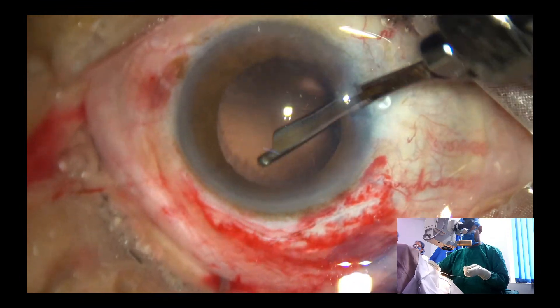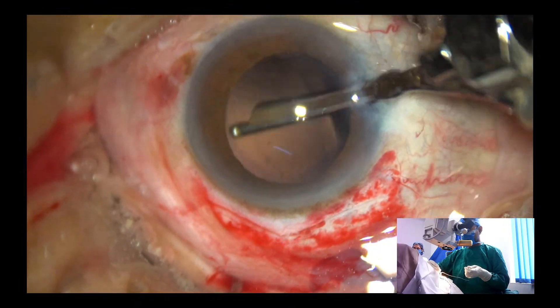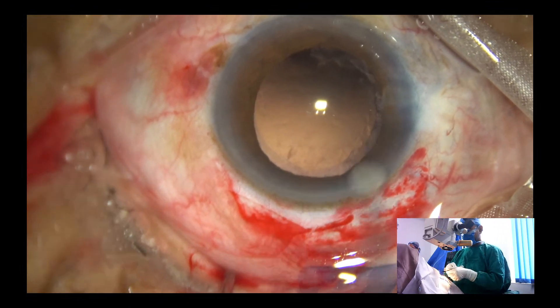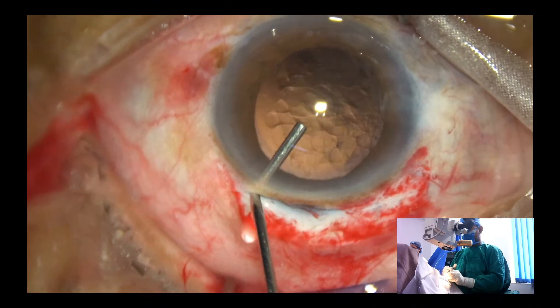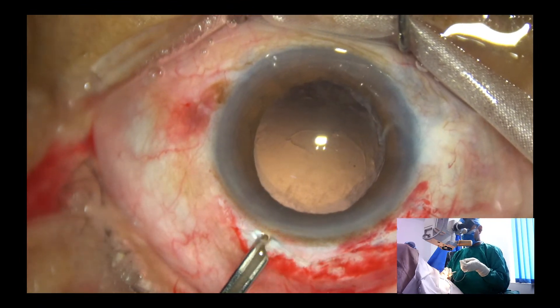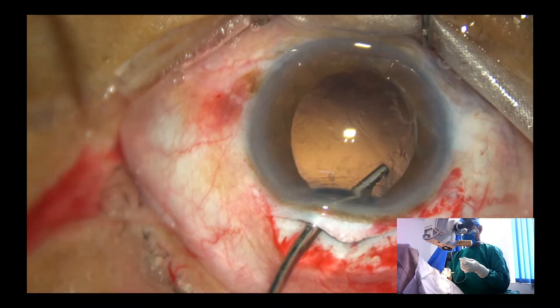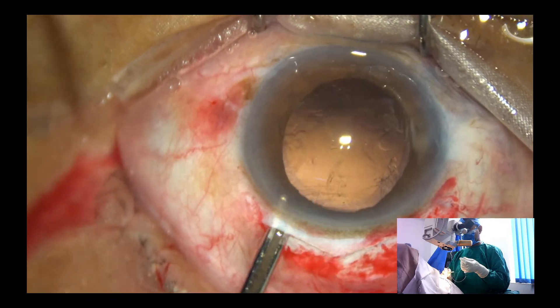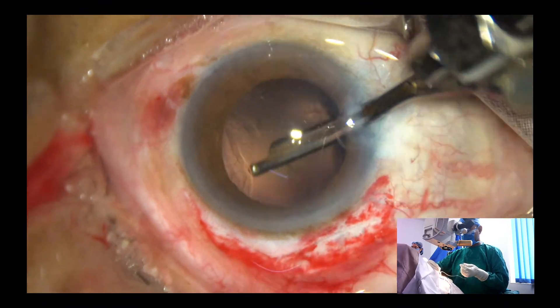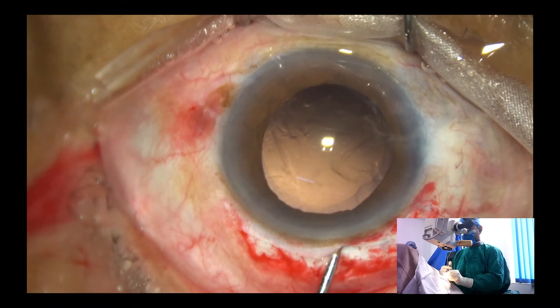A little bit of irrigation towards the cornea. And now just clean the cortex. Inject visco. If we want to aspirate cortex through the main wound, you must inject visco in the anterior chamber and fill the bag. Then you can aspirate — the anterior chamber will remain formed for some time. During that time we should be able to remove the cortex.